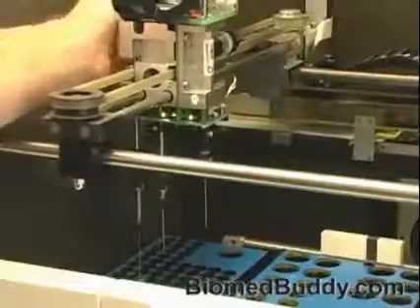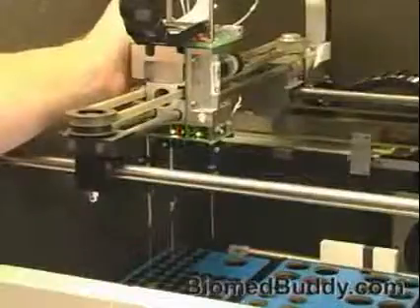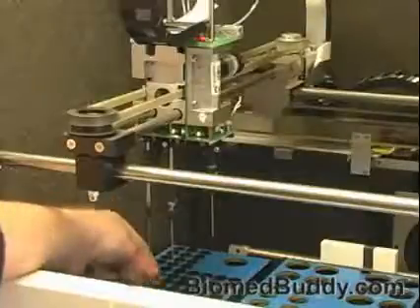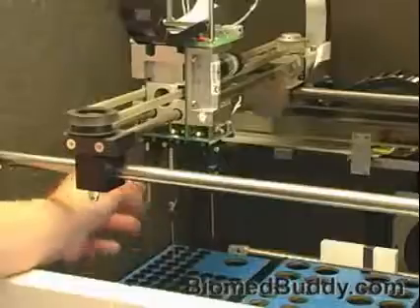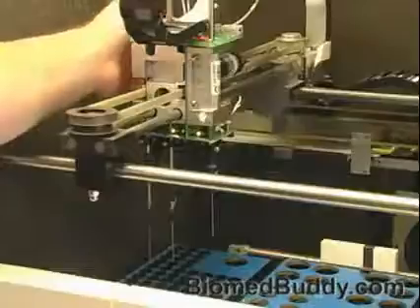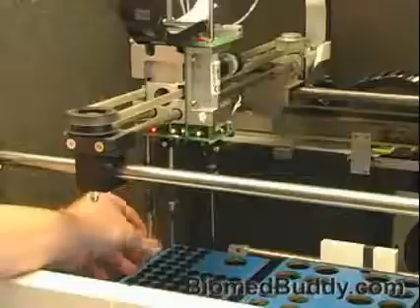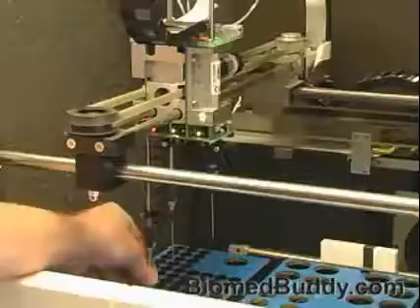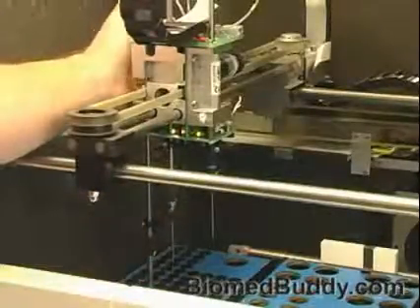Notice that the only position on your mapping is for needle number 1. It's good to understand this, because you're only mapping needle number 1 at this point. I'm going to take my adapter off. Then I'm going to do the Z part. This is where arm number 1 is going to take the needle, and from here it maps it to all of the positions. So you need to get this right, and I'm going to go all the way down to the bottom. And you have to go to the bottom because that is going to determine how low that needle can go.